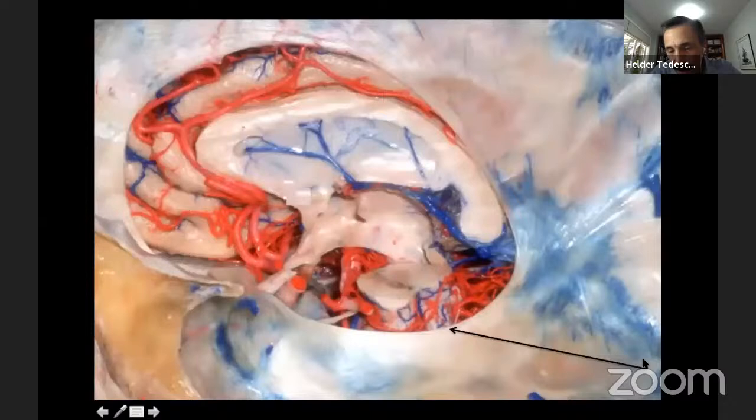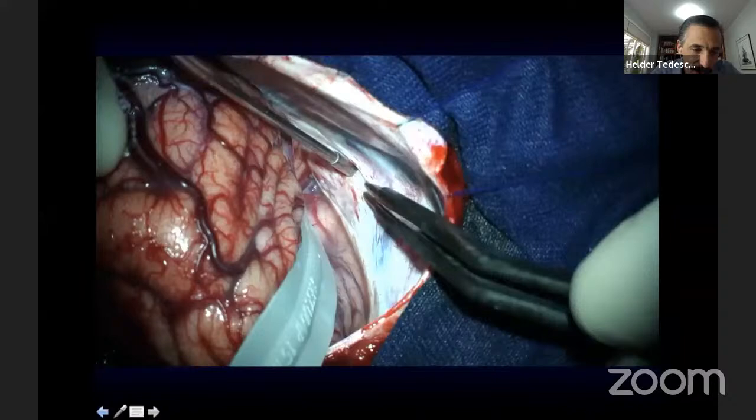And this portion here, I can lift up with stitches, and I can also place stitches below here after lifting this flap up to make an arch, like an arch with straight sinus, so that I can have a view towards the other side.